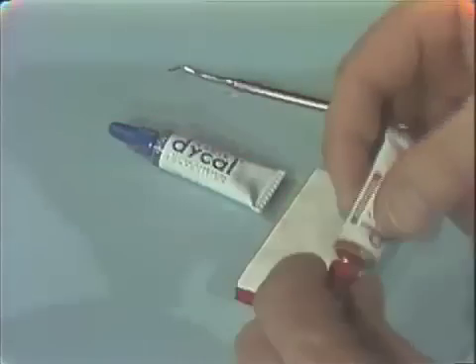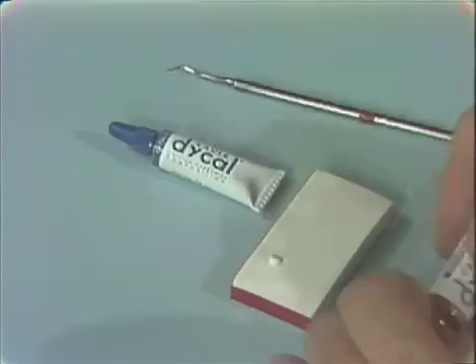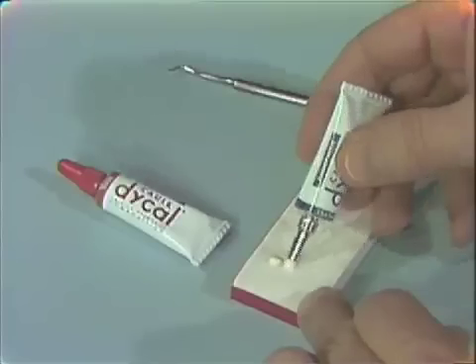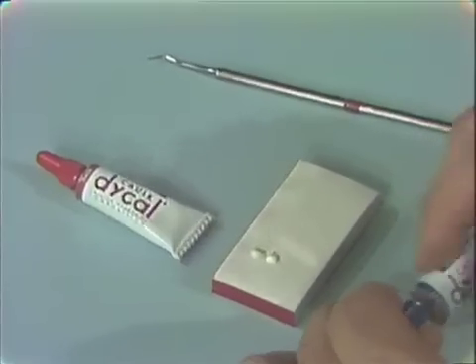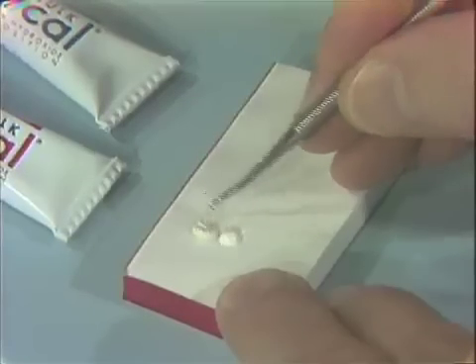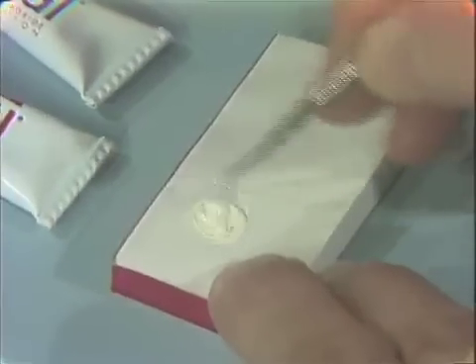The base material is dispensed in approximately a two millimeter amount onto the paper pad. The catalyst, which permits the material to form a firm membrane over the exposed pulp, is deposited in a similar amount. With a clean spoon excavator, the materials are mixed together to a uniform color. This can be done in a matter of a few seconds.